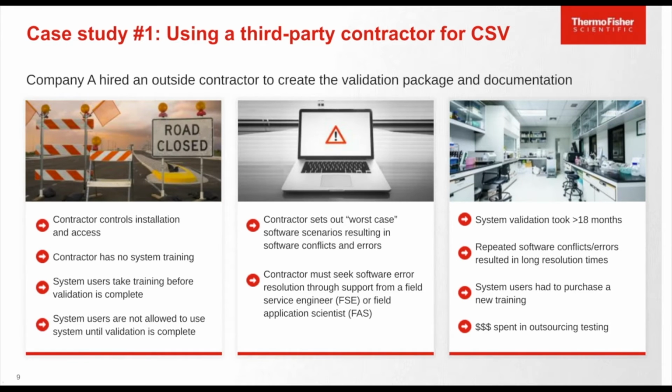They're looking to test the system to make sure that they enable it to pass any risk that might take place. So this ended up resulting in software conflicts and errors because the contractor didn't know the capabilities of our MicroSEQ ID software.